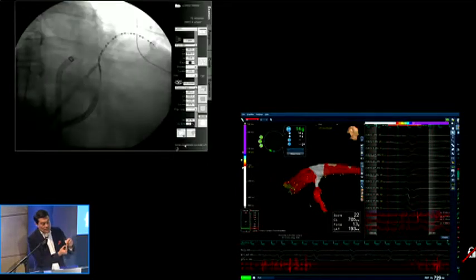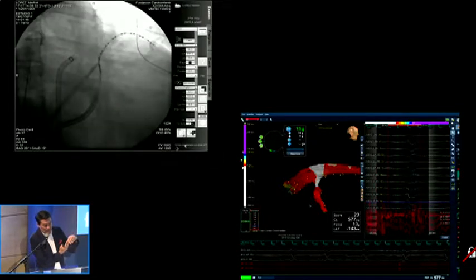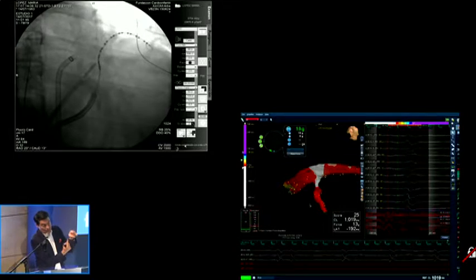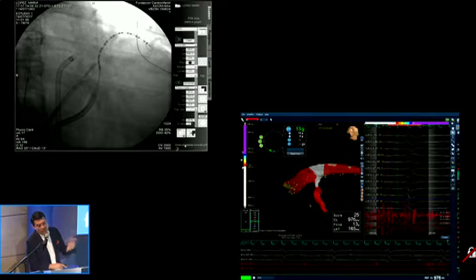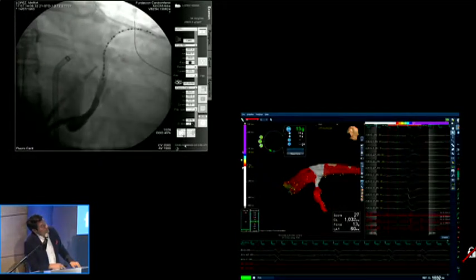Yes, generally what is done is to do the measurement from the tip of the endocatheter and what you have in the epi. But what's the key? Based on the echo, you assure that you have very good contact, because that is what brings you closer to the epicatheter. If you're above 1.5, generally you're going to fail. If there are no other options, we end up doing that, yes, because if you don't have a way to apply on the epi or to use alcohol, it's the only way out left to you.